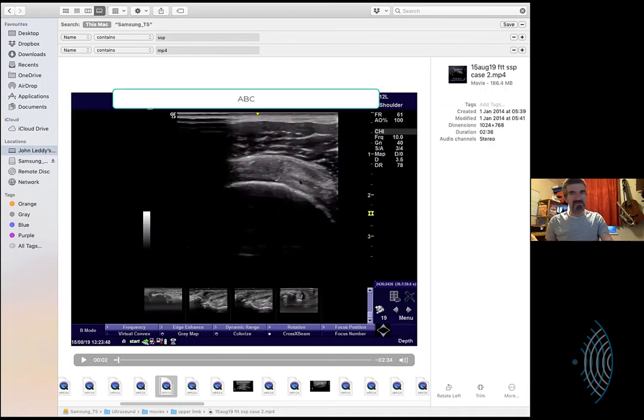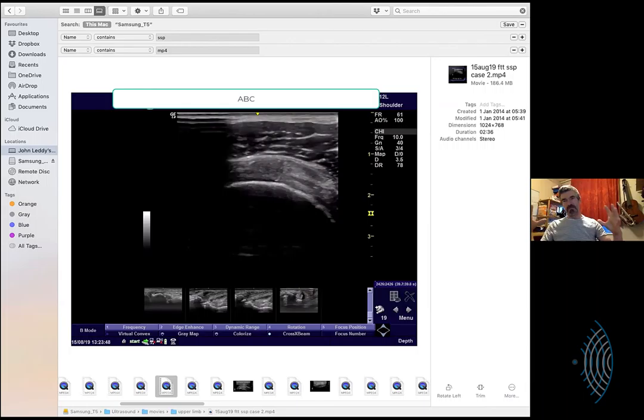Just there. This is biceps. Yes, there's a layer of tissue. Yes, that's what you're saying is the cable. Yeah, or cable, capsule, thickening of the capsule, whatever you want to call it. I see a lot more of it than they describe in the textbook, so I think I'm seeing parts of the capsule as well as that. I'm not always looking for it; sometimes you see something that's quite clearly a cable.